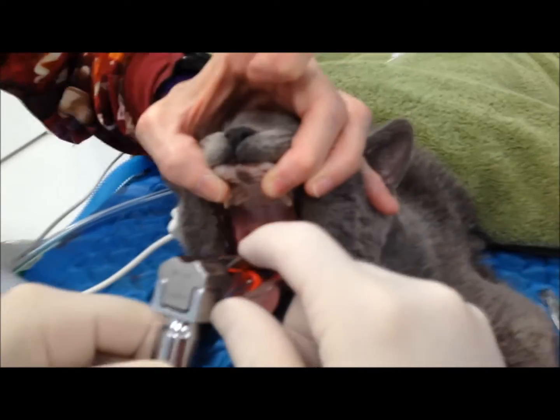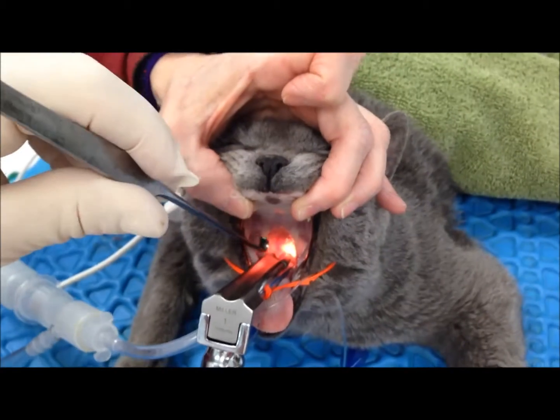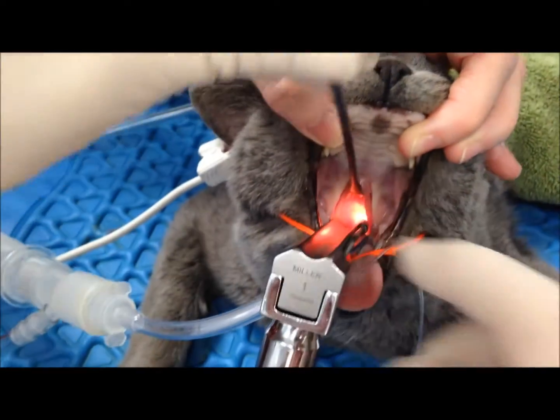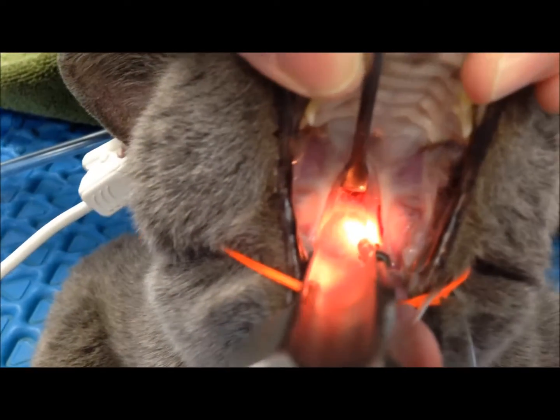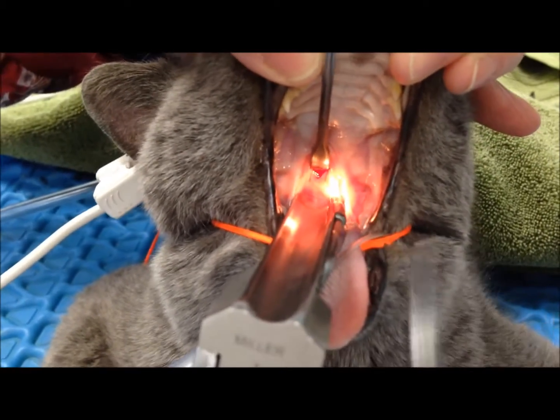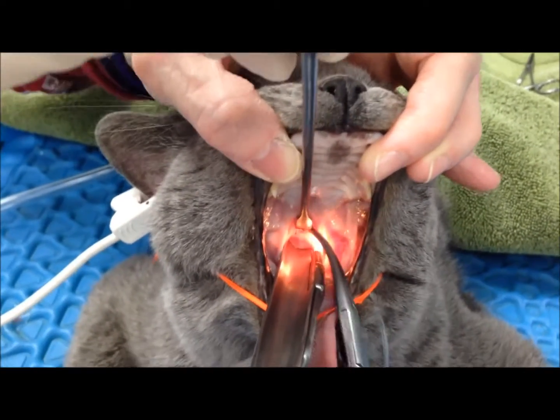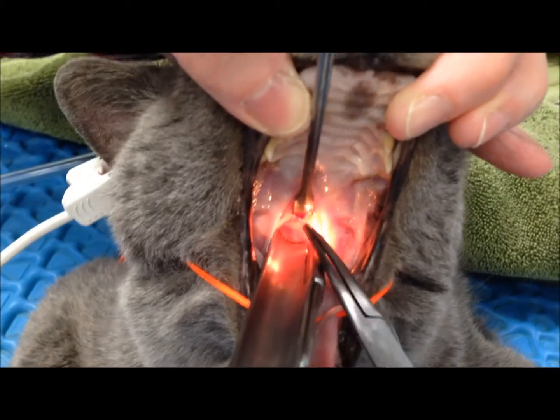Mary, go ahead and hold this down. I'm bending the tip of that down a tiny bit. Relax, I'm going to angle you up — it's bleeding a little bit because we already went in there. Just teasing it open a tiny bit.